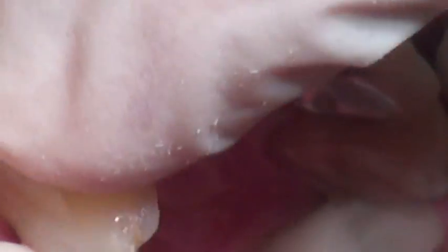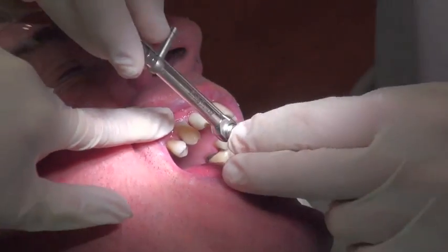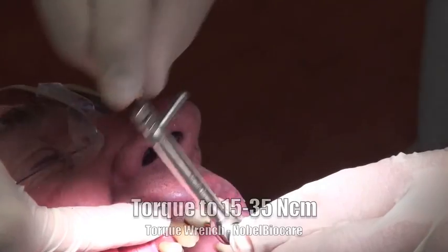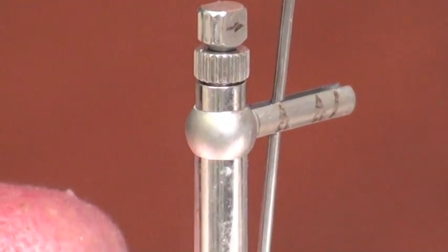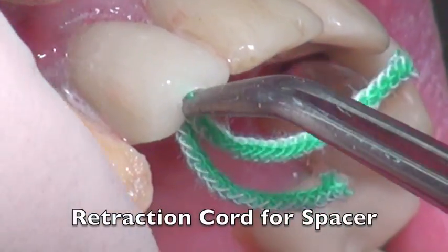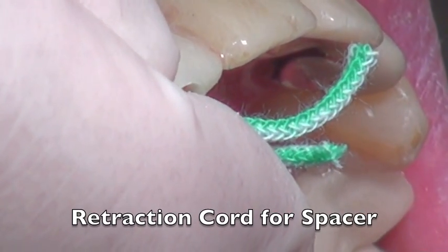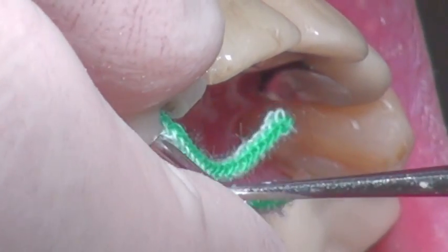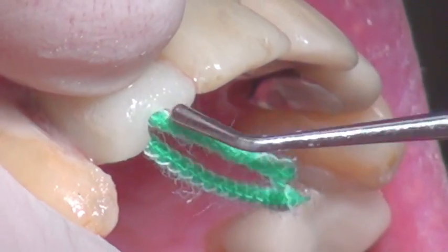In the x-ray you can see it is sitting down quite nicely — the cylinder is where we want it to be. Once we torque this down to 15 Ncm, you can actually go up to 35 if you want to. I like to stay at 15 because we are dealing with an implant that is torquing up to about 70 newtons, so there is no problem going up to 35. We take some retraction cord and place it inside the canal area of the implant cylinder — I do this instead of cotton because it is a little bit easier to remove later on. We place this cord in and then put some resin in behind it, tucking the cord up inside, which will prevent resin from going into the screw.